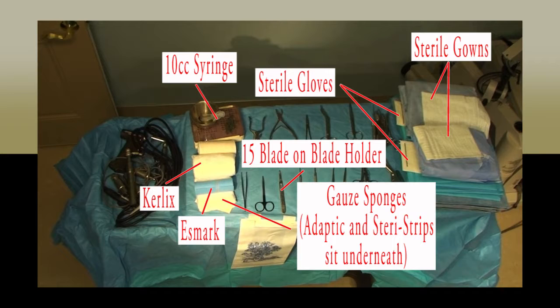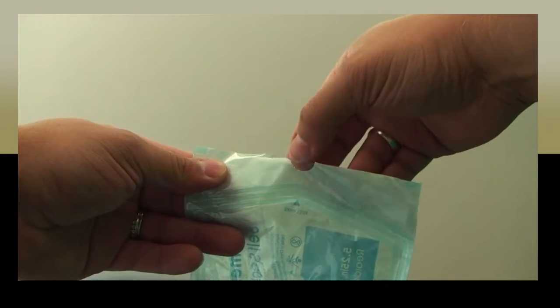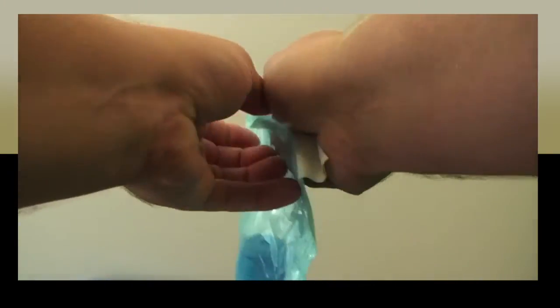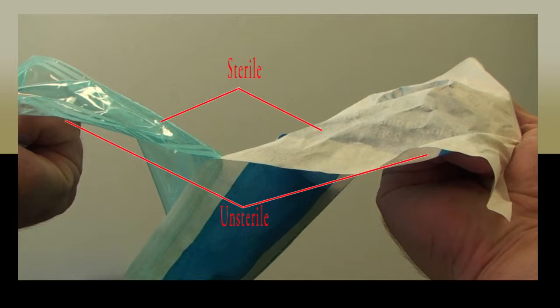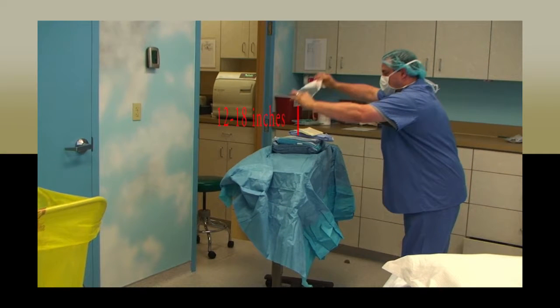When opening and passing materials to a sterile field, you will need to adhere to the aseptic technique. To do so, when opening the sterile pack, you will place both hands at the top portion of the peel pack and slowly and evenly peel back both sides so as to open the inside sterile side of the flap out, and the non-sterile side will fold around your hands, covering them from the sterile material. You will then flick the material onto the sterile field, standing 12 to 18 inches away, as shown here.